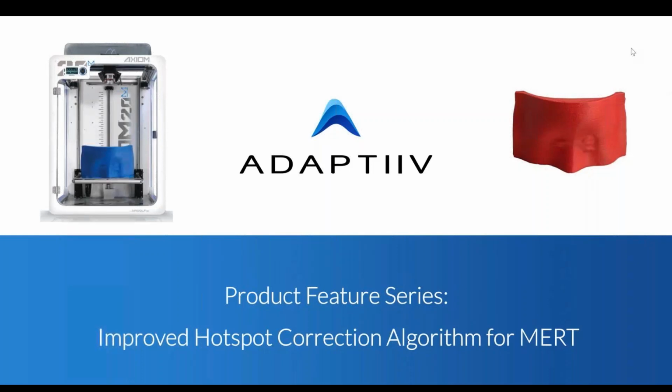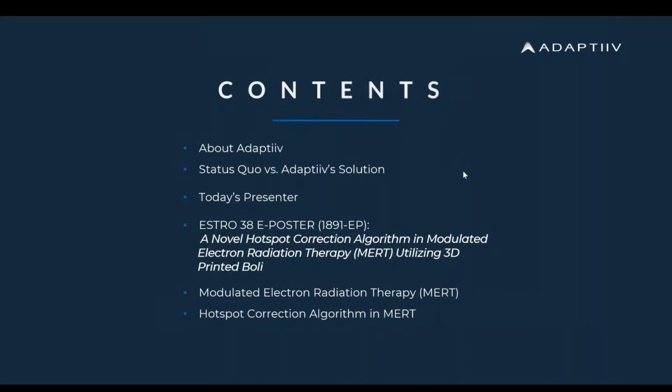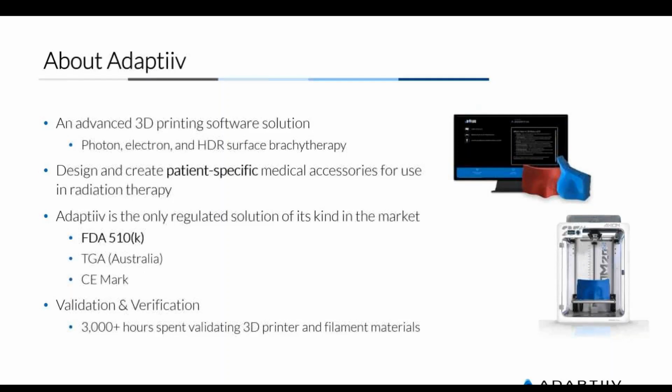Before we go too far in and let our specialist speak, I'm just going to give a brief overview for those that don't know about Adaptiiv and what our 3D printing software solution does. We'll take a look at traditional approaches to electron therapy, radiotherapy, and our solution, the modulated electron bolus that we offer in our software, and then we'll get right into the details of today's product feature.